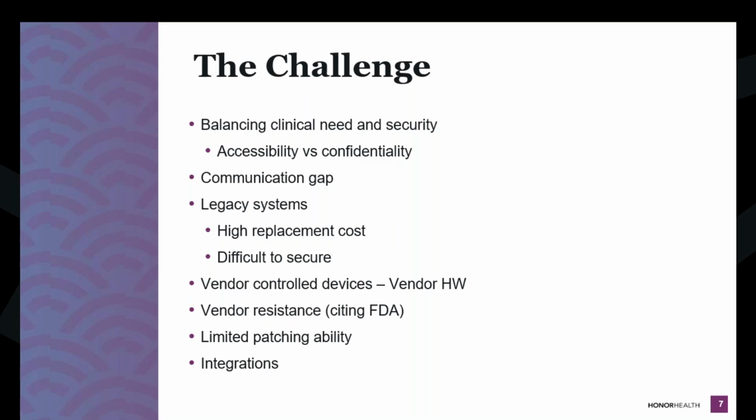Yeah, and just to add to that, if you think about it, we're on Windows 11 now. There's 3 upgrades that went through between the time the FDA approved the old device, right? And if you think about it, they're even on 10-year cycles. You only have 5 years before you get the next version of Windows, right? So as you're buying this equipment toward the end of when they're selling it, you might only have 2 years, right?